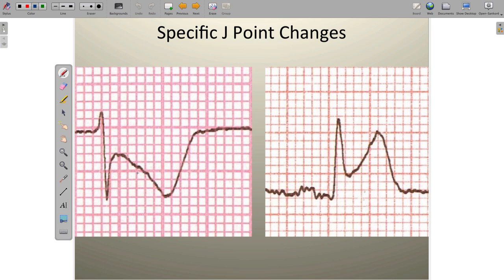There are a couple of rules to follow. The first rule is that under no circumstance is it ever okay to evaluate the location of the J point against the PR interval or PR segment. It is never okay to do that because the PR interval may also be up or down — it may have departed from the isoelectric or baseline — and we wouldn't want to compare two variables against one another. Instead, the rule is that the J point is only and always evaluated against the isoelectric line.